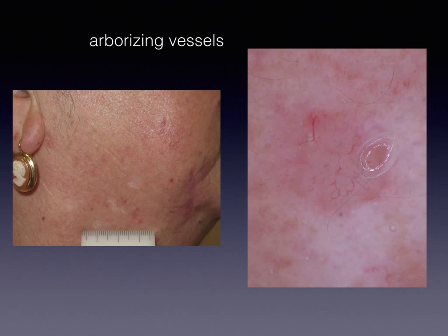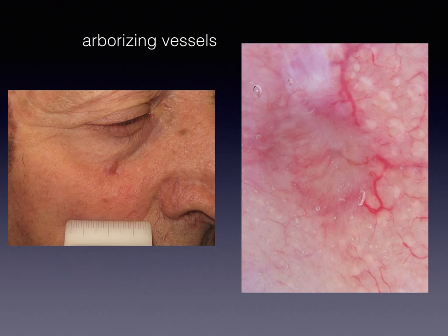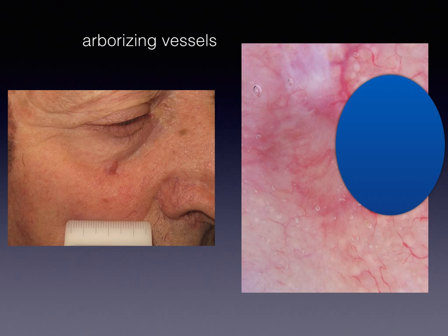Again here, the vessels are not large, they do not cross the center of the lesion and are not in perfect focus. However, they are always linear and branched. This BCC is even less typical in terms of vascular pattern — please ignore the vascular structures of the surrounding skin. The tumor vessels are far from typical, but it can still be seen that they are linear and somehow ramified.